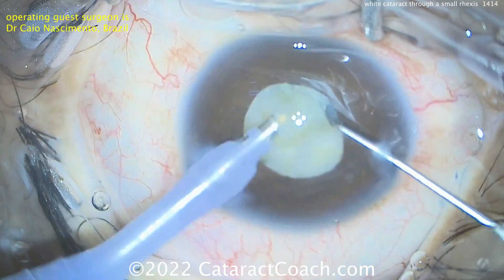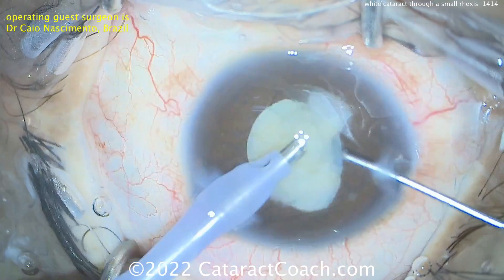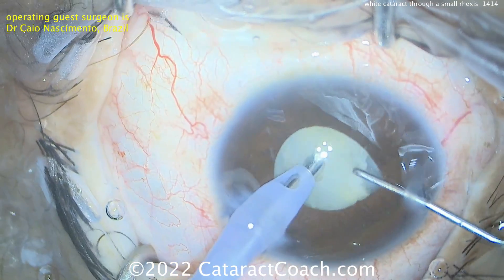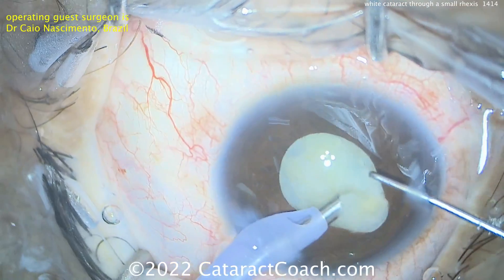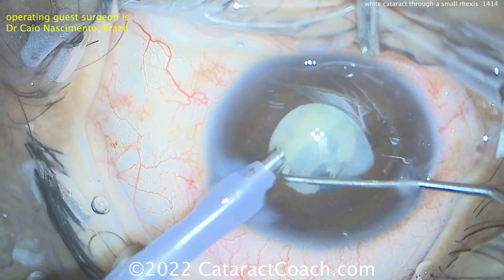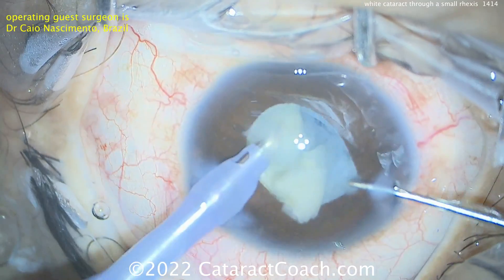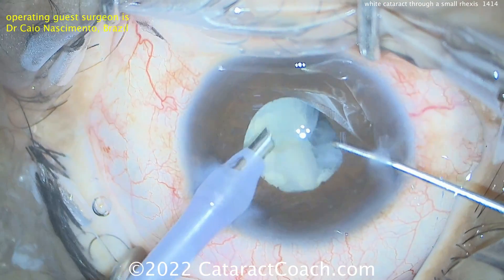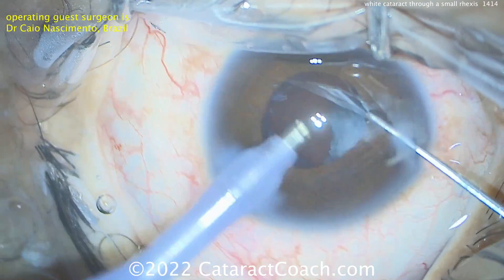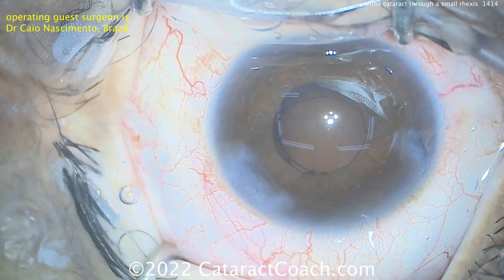I don't know this surgeon personally, but I'm really enjoying watching this video. A little piece of the nucleus being broken off, and look how the surgeon is very carefully staying in that central zone — staying away from the iris, operating very centrally in the deepest part of the anterior chamber where there's the most working room, and obviously away from the pupil so as not to catch the iris. Nice, methodical chops. About half the nucleus is already gone, and this is going to proceed pretty quickly. The dexterity of that non-dominant right hand — the ability to chop, manipulate, and move that nucleus — is really quite excellent. Now the last bit of nucleus is coming out, all being done through that smaller pupil and small capsulorhexis. This is a surgeon who knows exactly what's going on and is very much able to adapt.